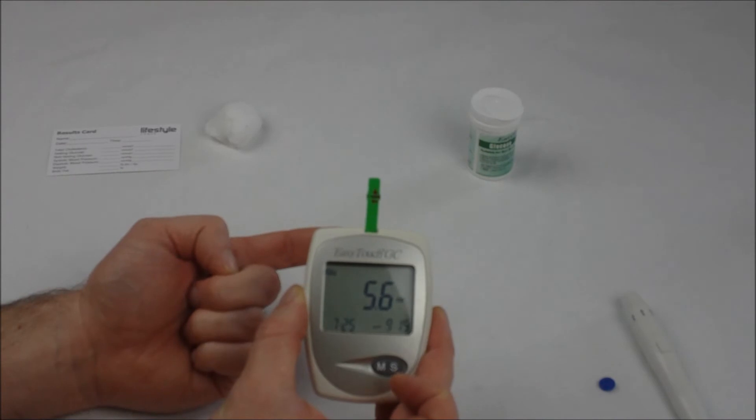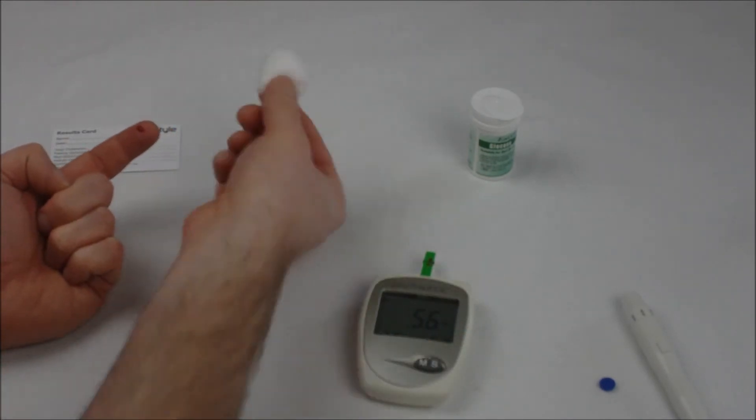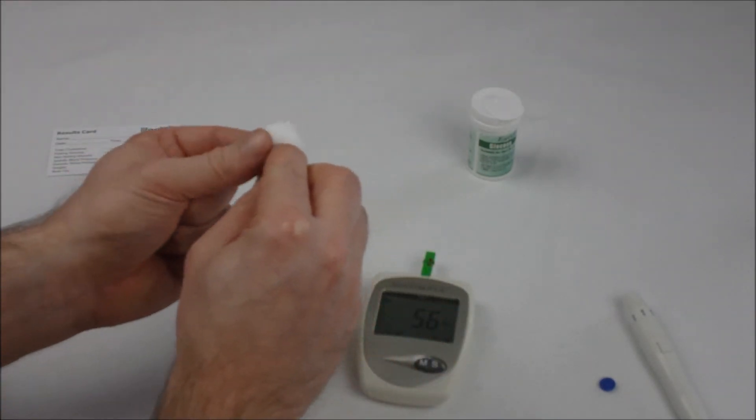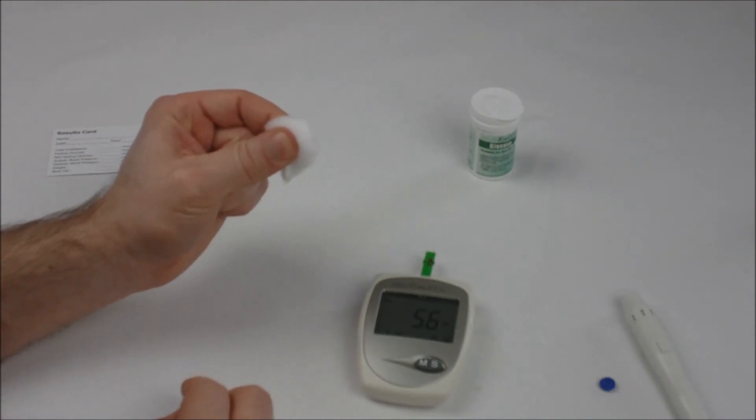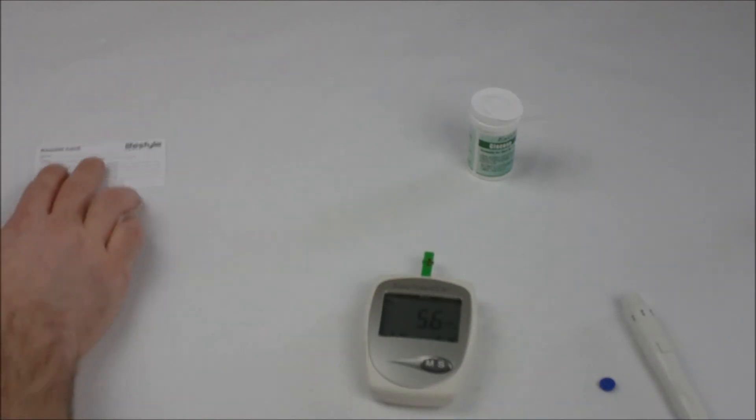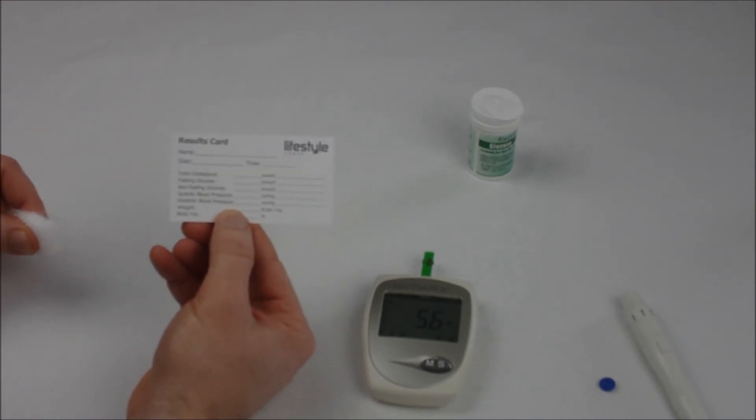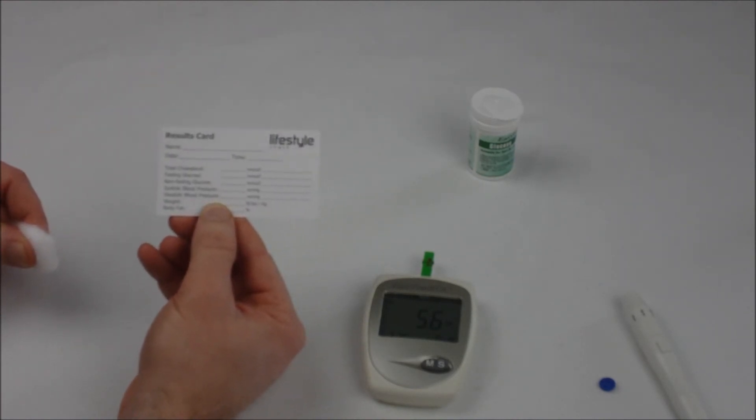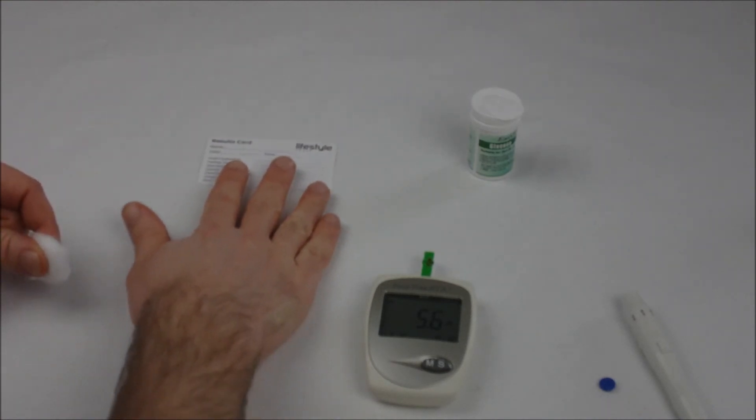Mine's 5.6 millimoles per liter. It's a good idea to have some cotton wool around to hold over your bleeding finger. That should stop in a minute or so. Then you can take your 5.6 measurement, or whatever yours is, and write it on your results card alongside your fasting glucose.